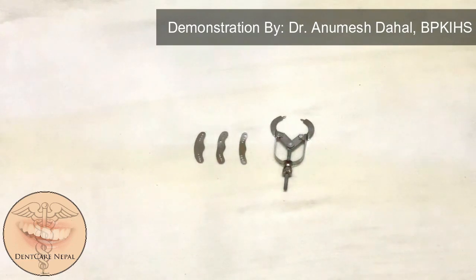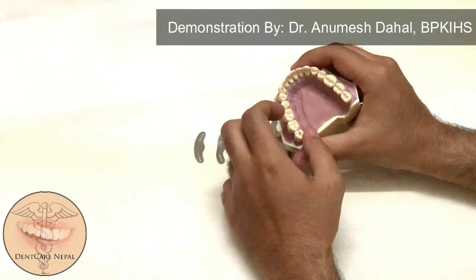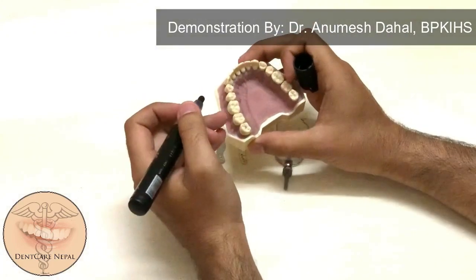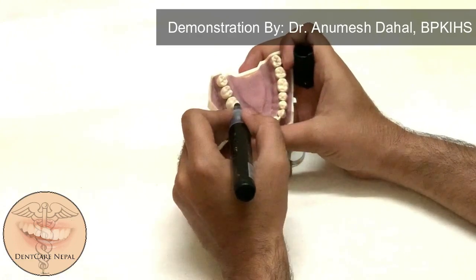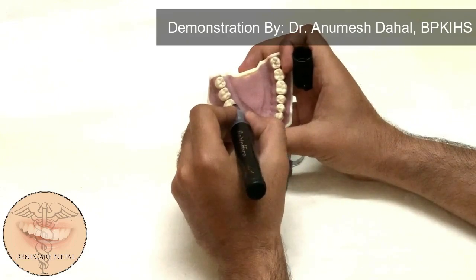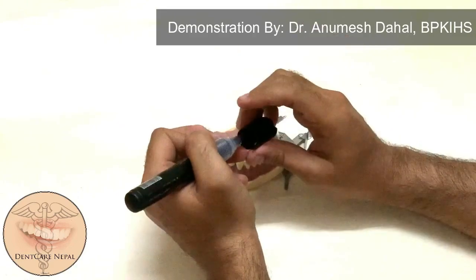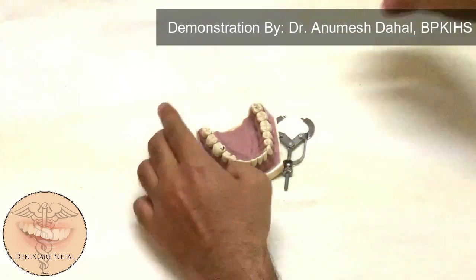Hello guys, in this video we'll be looking at different types of matrix band. Today I'll be demonstrating how to place the ivory one matrix band. Although there are different types of matrix band in the market, the ivory one is a good one to know. Matrix bands are especially useful when we have to restore proximal cavities — for example, when tooth 4-6 has a mesio-occlusal cavity and we have prepared the tooth for a restoration.